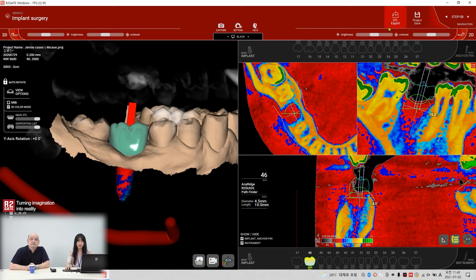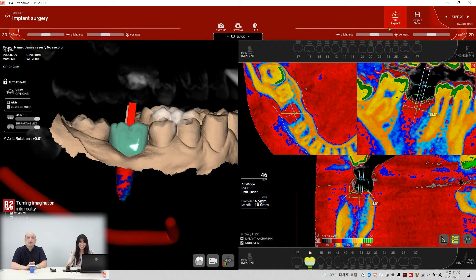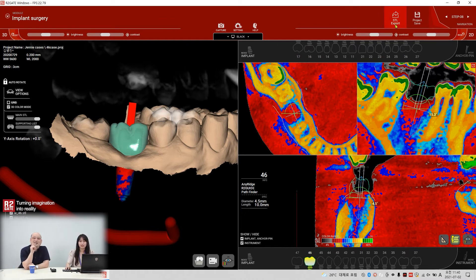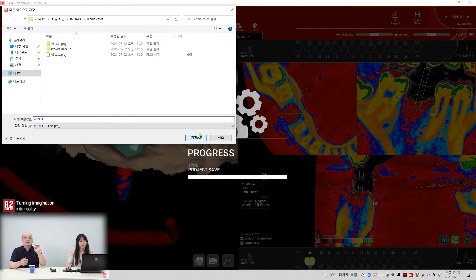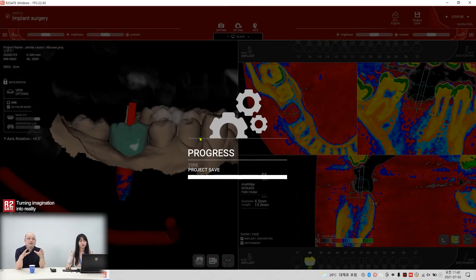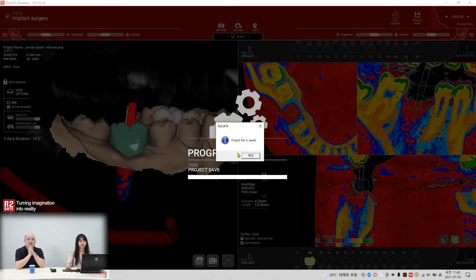Next is guide design. But before you export, you have to save the project. Save the project — save all your work to the project file.